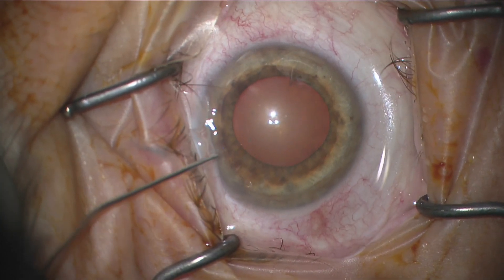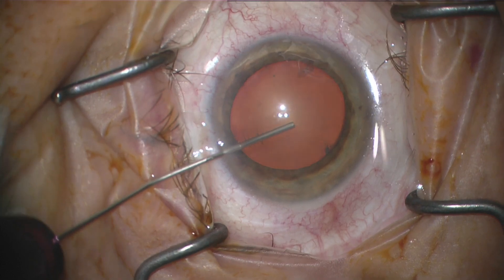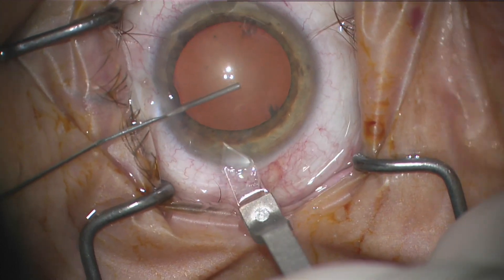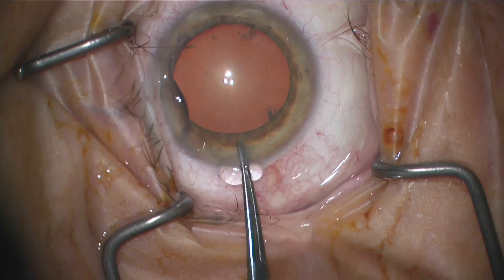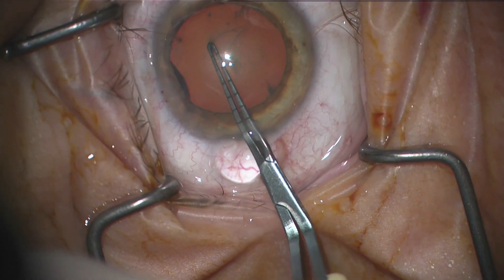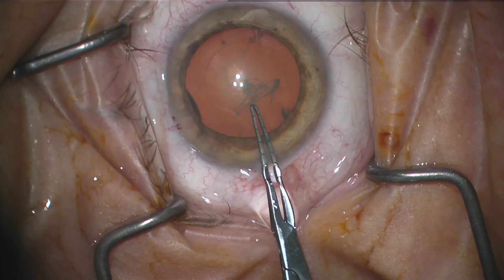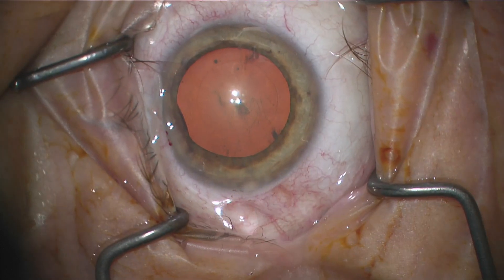This part here is a little bit sped up two times just to get us to the actual device. Basically what's unique about this device is that all of the mechanics are in the actual handpiece itself. There's no machine that does phaco emulsification — no ultrasound energy breaking up the lens. It's actually a mechanical process occurring through the handpiece itself to remove the lens.